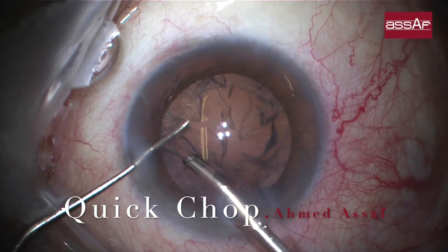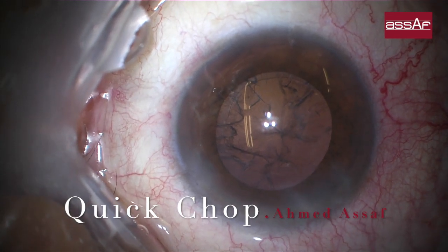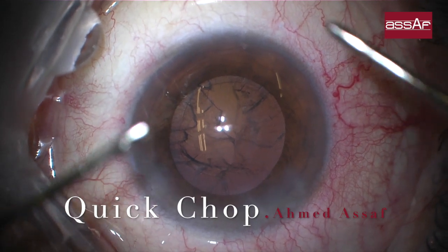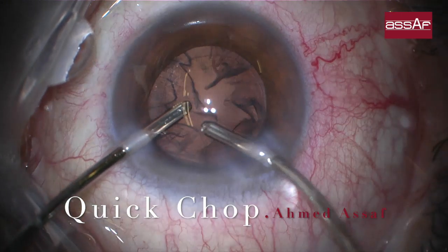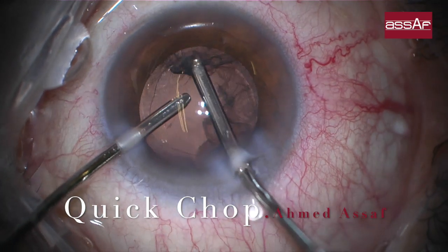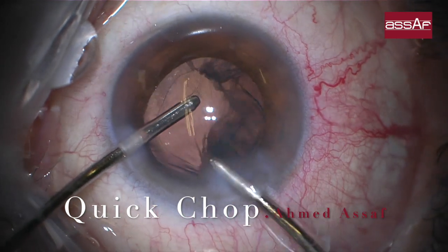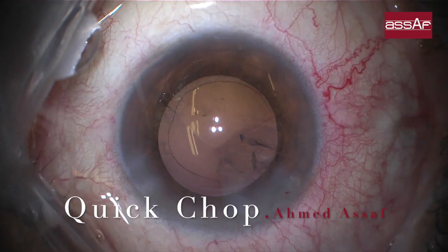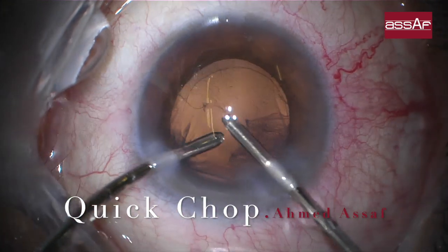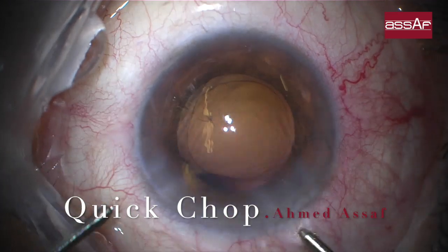The settings are similar to the quadrant remover phase of divide and conquer: use high vacuum around 300 mmHg, adjustable to your convenience. Aspiration rate should be around 30 cc per minute. Ultrasound should be around 70 to 80 percent depending on the phacoemulsification platform, kept in linear mode to increase or decrease according to the density or hardness of the nucleus.